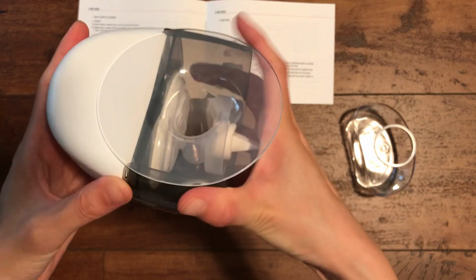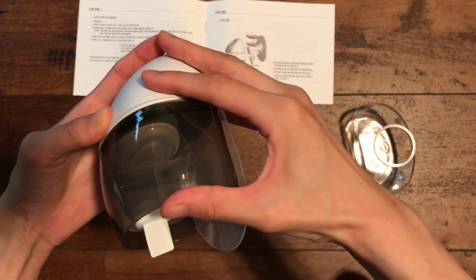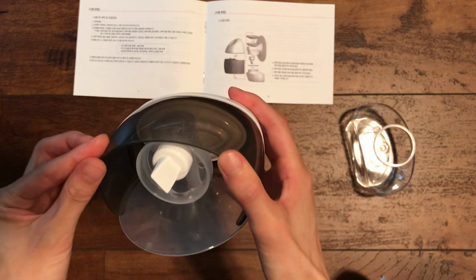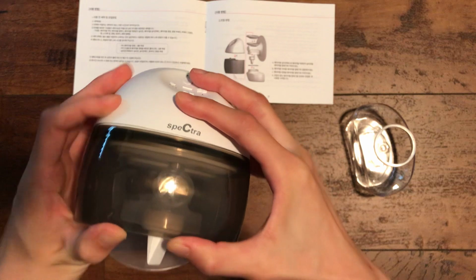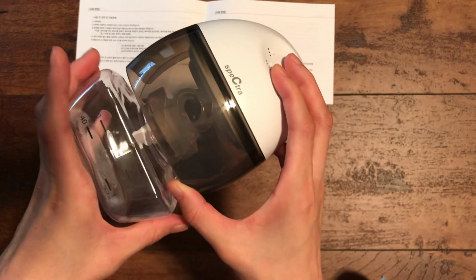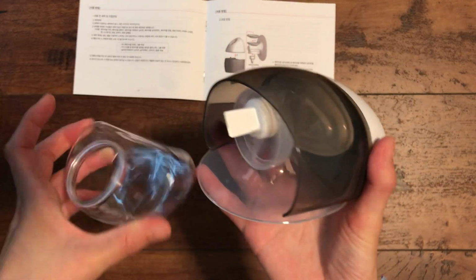And then I turn around and push in the rest of the parts. And then it's easy to grab onto the edge of this cover, and to do that, I go around, start here, and then push along the edges. And yep, that's it. So if you have the bottle here, it would be kind of hard to use the edges to push. So that's why I recommend putting in the unit first, and then the bottle comes last.